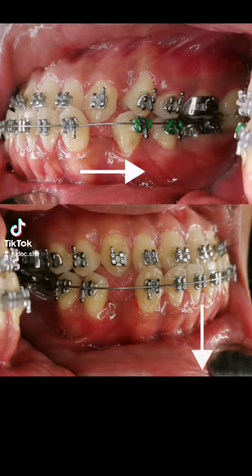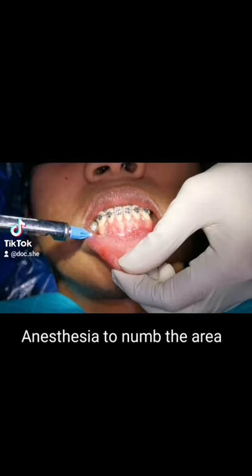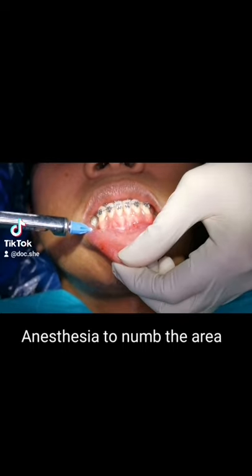I wanted to push his teeth downwards and then backwards, so I placed TADs, which are small titanium screws. I'll use them as an anchor to facilitate tooth movement.